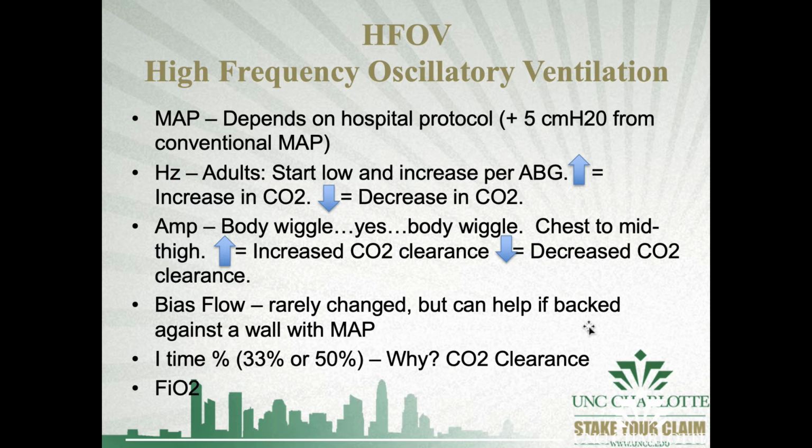So there's a time and place for everything, but I'm not sure how experienced everyone is in this course with the oscillator, so I tried to make it as simple as possible. This is an adult-centered course as well, so my pediatric RTs probably have more experience with HFOV versus our adult respiratory therapists. But let's just break it down, keep it real simple.